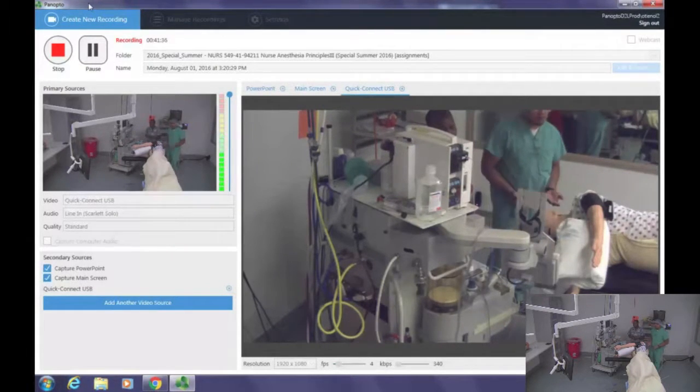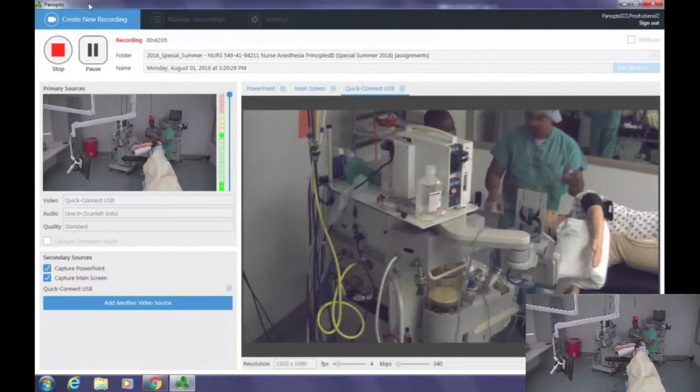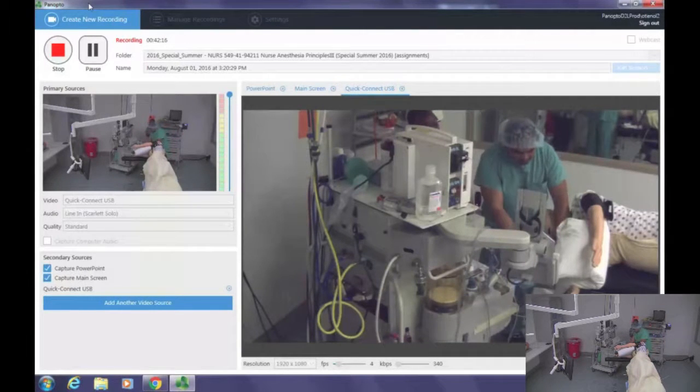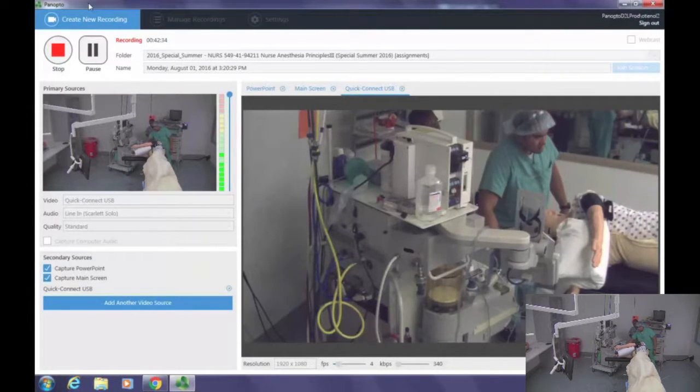Now, during one lung ventilation, you might encounter that the patient could be hypoxic. For that you're going to use CPAP. You're going to put this on the auxiliary oxygen, around 5, and connect this to the lung being operated on. Basically, it's anywhere between 5 to 10 centimeters of water to insufflate it. So basically, we're insufflating it.